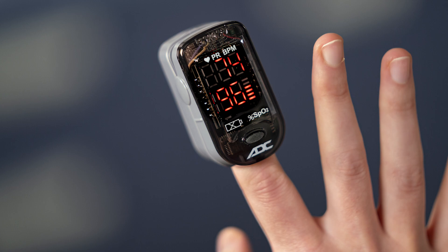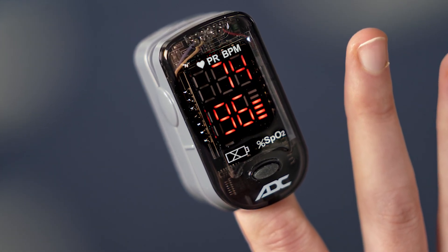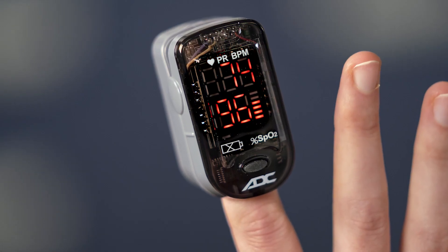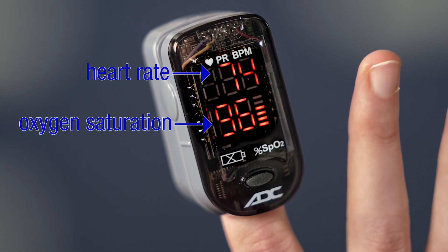This is a pulse oximeter. It has sensors that are placed on the skin. Some pulse oximeters are battery operated and others connect to a power source. Many have just one or two simple buttons to turn on the device and provide the measurement information. Bright light, such as sunlight, may interfere with the light detector and cause inaccuracy, so when possible, use them in areas without direct sunlight. The pulse oximeter provides information about a patient's heart rate and oxygen saturation, or SpO2.